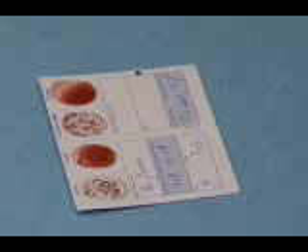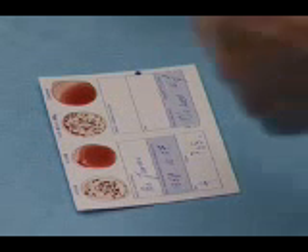The drying process can be speeded up by using a hairdryer. When the card is dry, cover the circles with the adhesive plastic film. This protects the results of the blood grouping and contains any infectious matter that might be present in the patient's blood. The adhesive plastic film can also be used to attach the Eldon card to the patient's records.